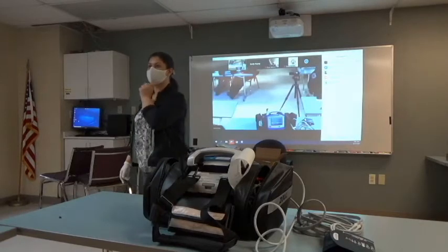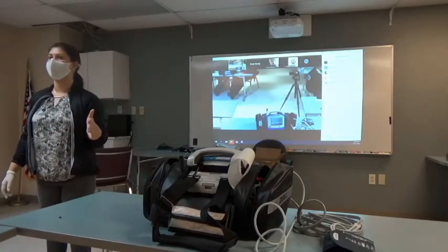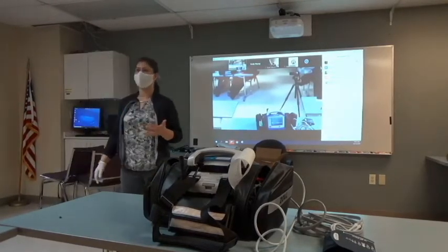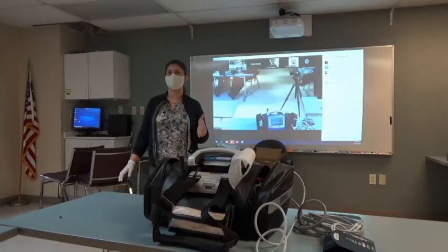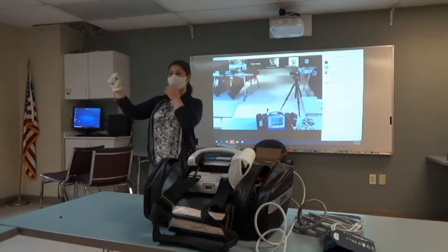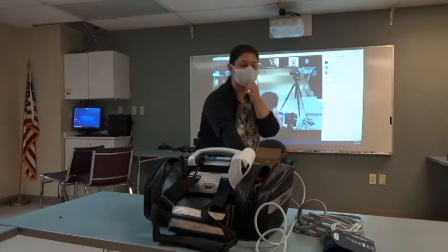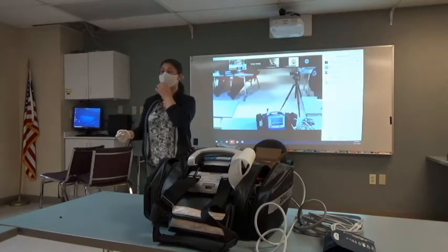Capnography, I'm just going to talk about, because if we press the button right now, it's just going to beep at us because we don't have anything attached to it. It's the same system you guys are using today. The only thing I'm going to emphasize is always work from your device first, patient last. So that orange piece that you guys have, it's a quarter to a half turn to the right on the vital signs side pouch. From there, this is a button push for an activation.